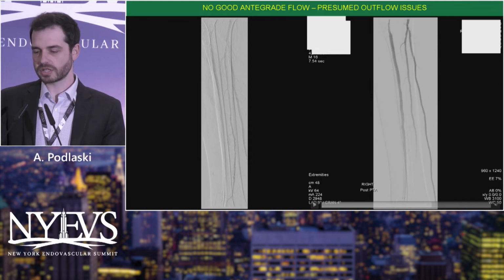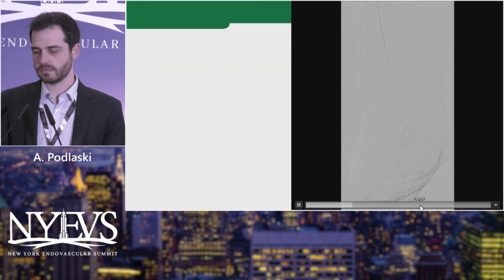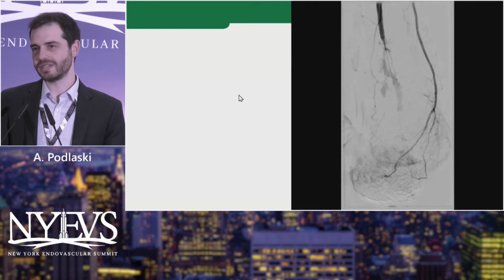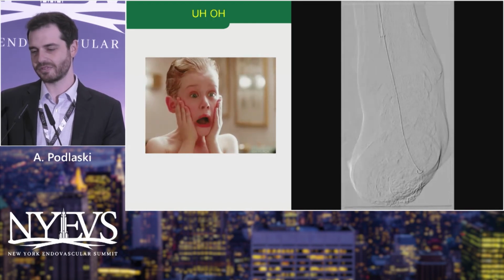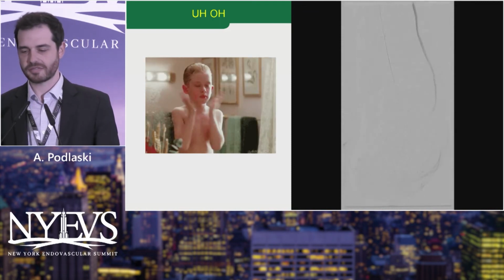So we did another injection with imaging a little bit lower down. Let me just skip forward a little bit here. And this shows what was the cause of it. We had extravasation from the distal aspect of our arterialization here, with contrast going into the soft tissues.